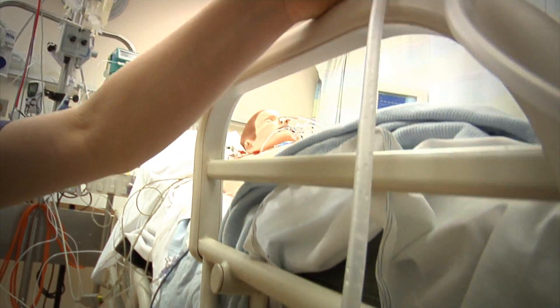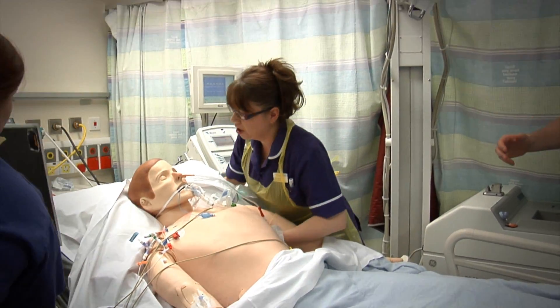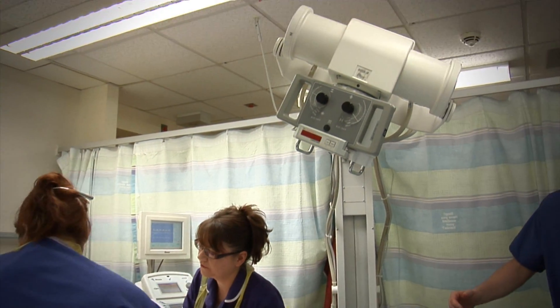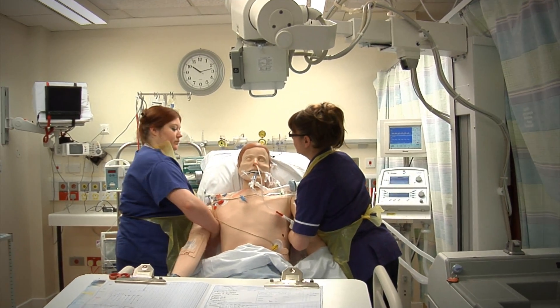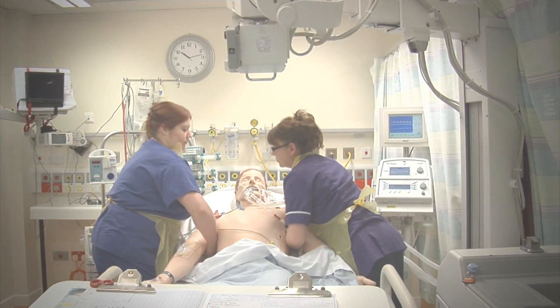You're forward, haven't you? Okay, well done. Okay, you're doing really well. Back down.